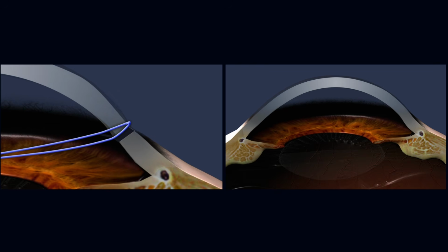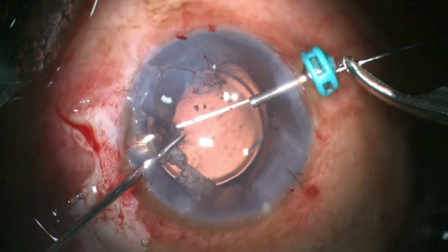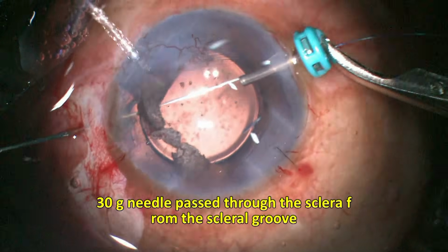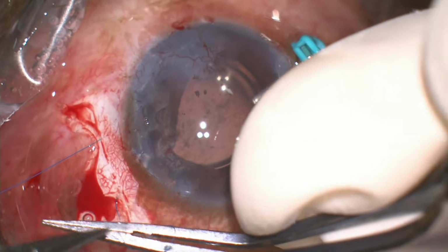Now, the common issue we face in iridodialysis repair is the suture getting stuck within the layers of the cornea. To avoid this, we introduce the trocar-assisted iridodialysis repair. Here, we place a trocar opposite to the area of dialysis and the double-armed Prolene suture is passed through this. We notice the ease with which the suture slides in and then passes through the root of the iris. The hangback provides controlled positioning, particularly in fragile or fibrotic iris tissue.